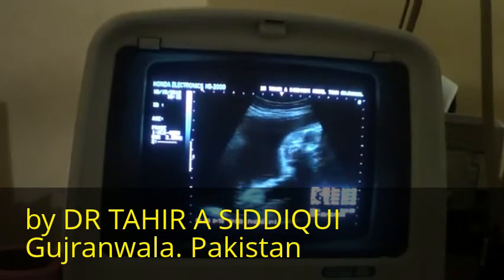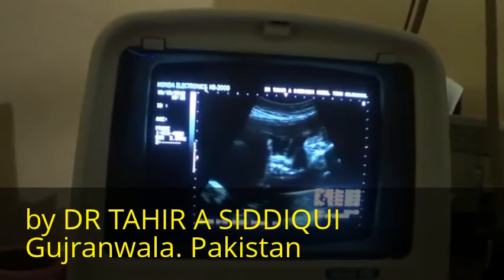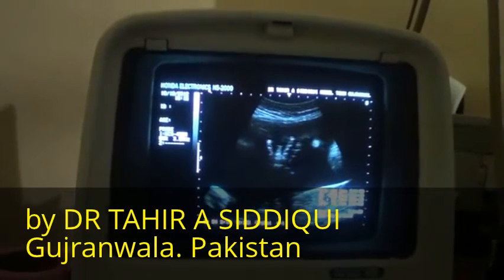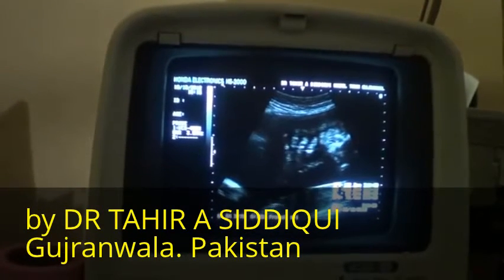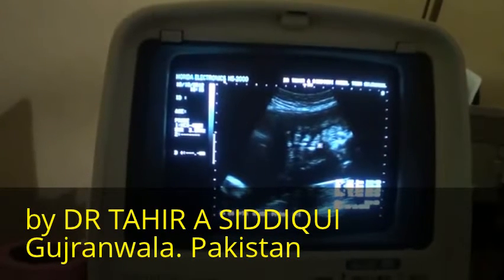See the limb movement. Here you can count the fingers. 1, 2, 3, 4, and the thumb.